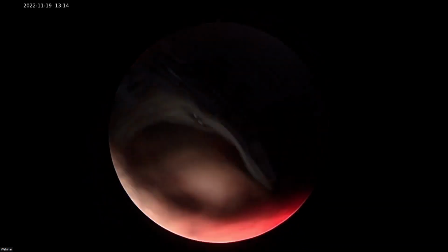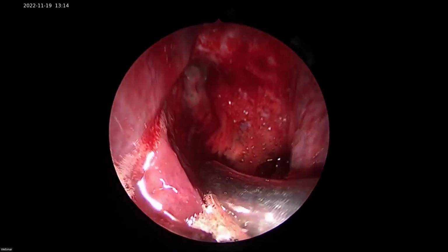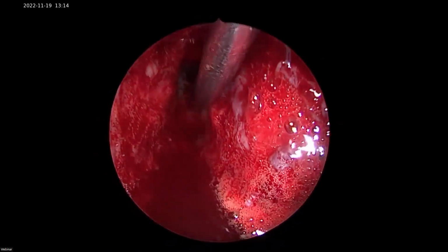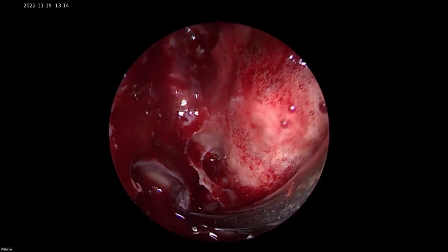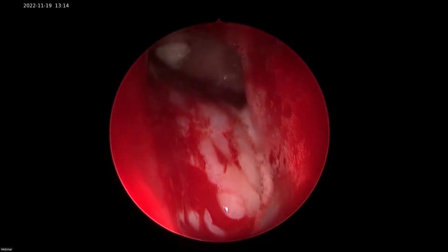If you don't mind, we'll start the other case. The moment you get this fungus out, you tell us, we'll come back to your frame. No, sir, you can go ahead and start. We'll manage that, but we want to see that fungus, all of them are interested, so we'll put you on the screen for a minute to show that. Okay, sure, sir.